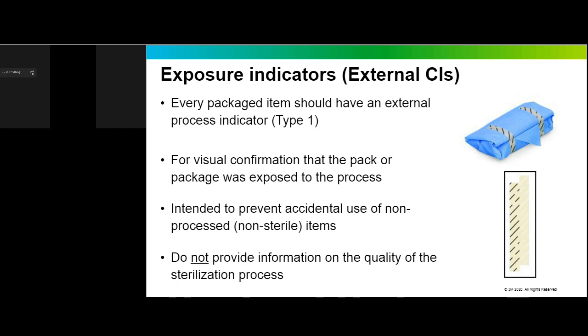So external indicators, they're not real sophisticated. It doesn't take a lot to get them to change. They don't tell us much about the quality of the sterilization process, but they are that first line of defense and make sure we know whether something was sterilized or not.